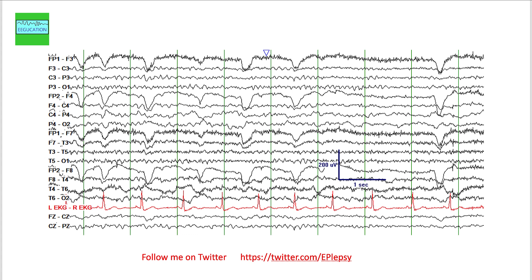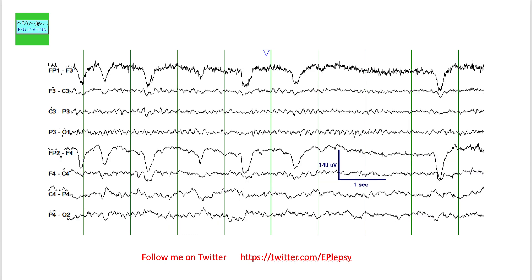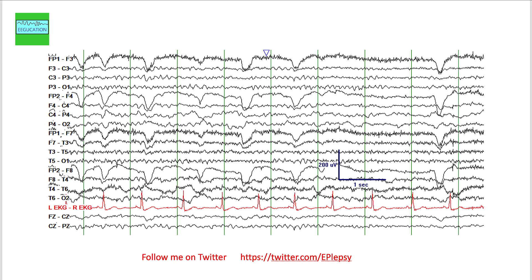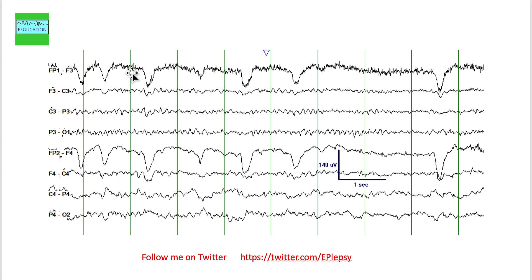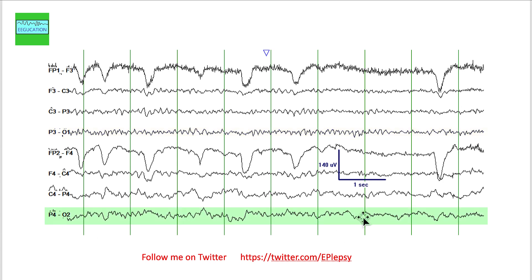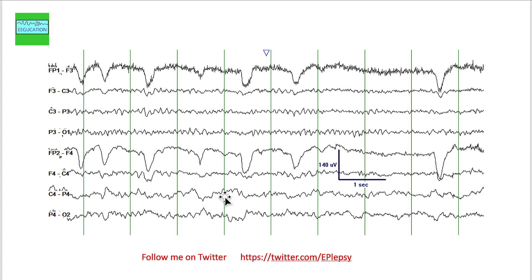To make it easier, I've taken only eight channels instead of the 16 or 20 displayed. Now it's easier to compare left and right sides. On the left side, starting with P3O1, you can see a posterior dominant alpha rhythm. But on P4O2, you're seeing slow frequencies with superimposed fast activity. Moving to C3P3, you still see some alpha rhythm, but also prominent delta activity with different morphology — what we call polymorphic delta activity.